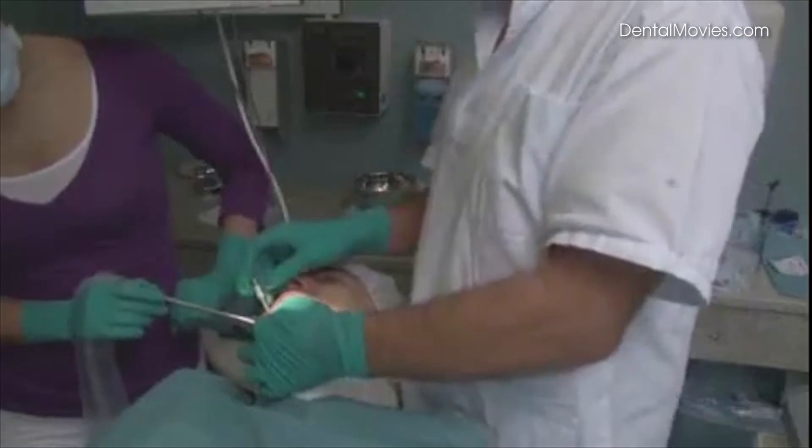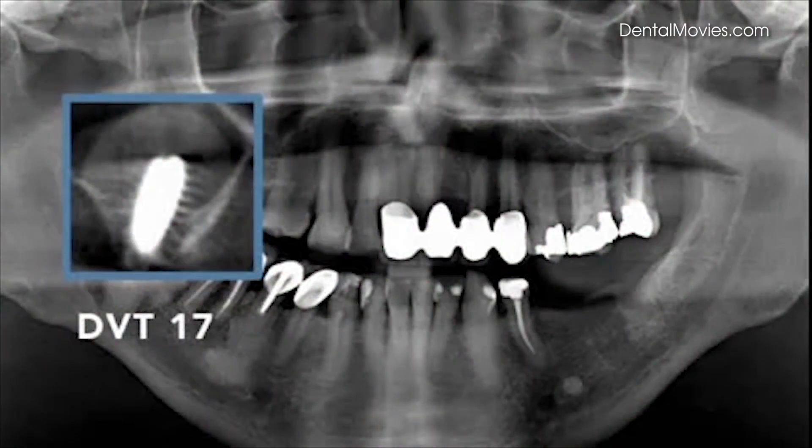Finally, the implant is set into position. The bone height could be augmented from 6 to 14 millimeters.